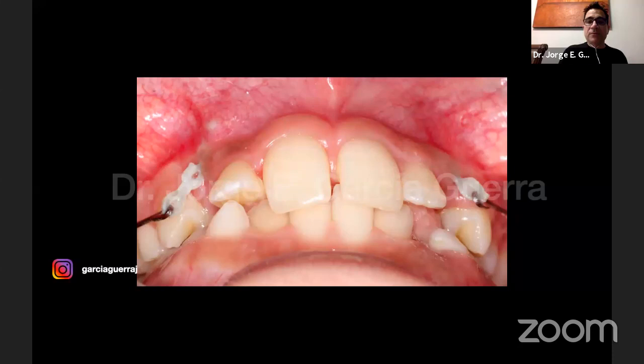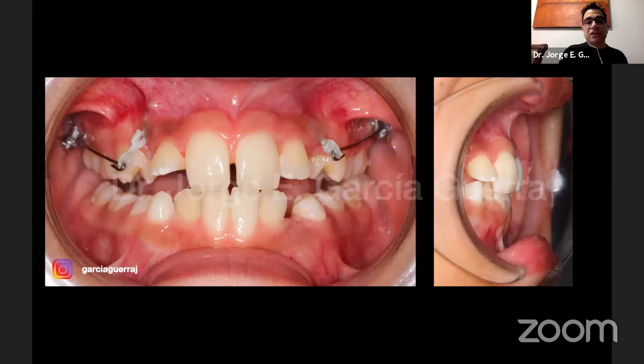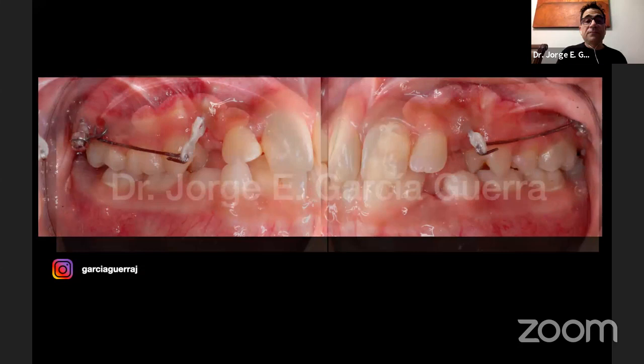You can see both sides. Now they both behaved very differently because of the position. The one on the right side erupted more easily, and the one on the left side, which was at the apex of the central incisor, was a little bit more difficult to retract. Okay, these are the pictures, and you can see the incisor there.